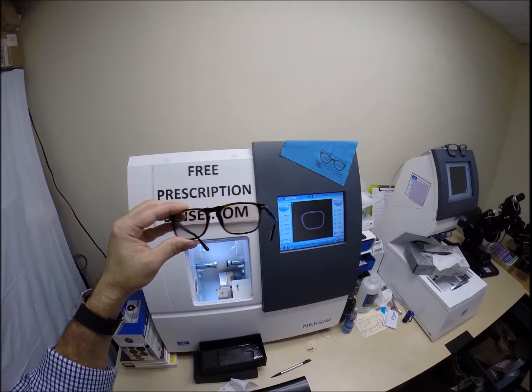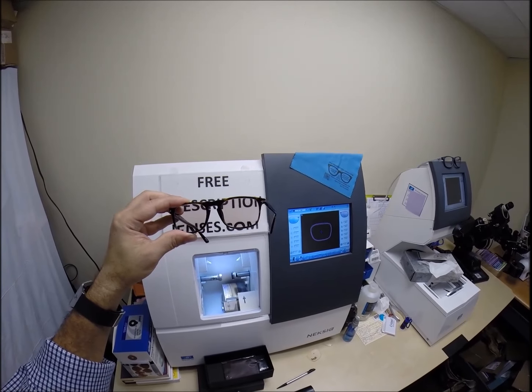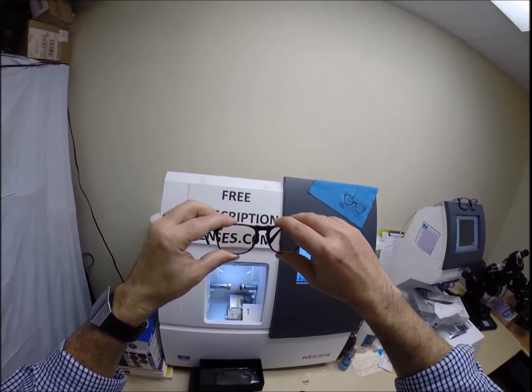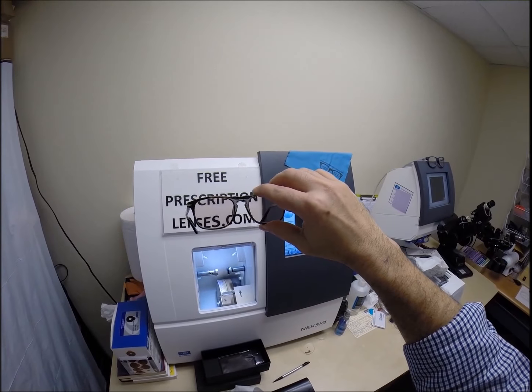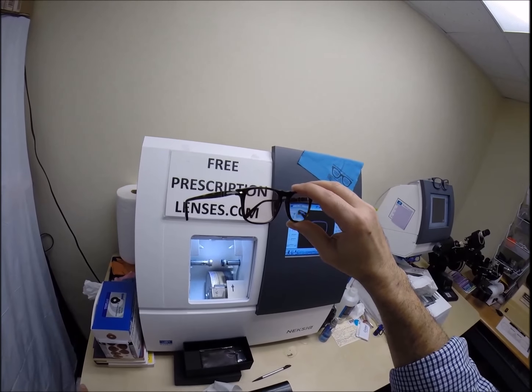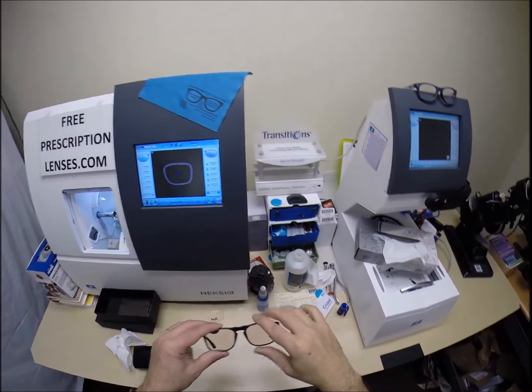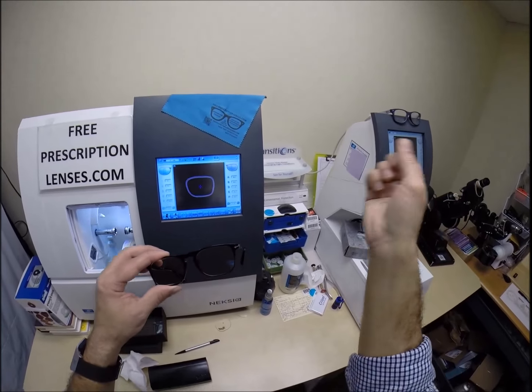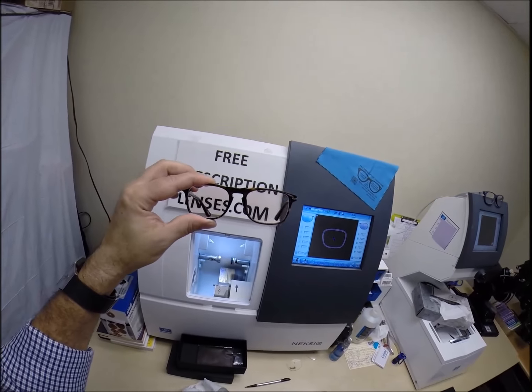Today I'm wearing the Ray-Ban 2132 New Wayfarer - sunglasses that I took the dark lenses out of and put in my clear lenses with Transition Signature 7 and Crizal Sapphire. Dale has Transition Extra Active Brown with Crizal Sapphire. When I turn my lenses over, here's a clear lens - there's about a 3% to 5% hue with Transition Signature 7. Dale's Extra Active are supposed to be about 5% to 7% hue while indoors. Transitions Extra Active have come a long way - it does cost more because it does more.